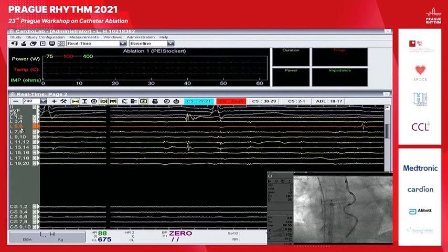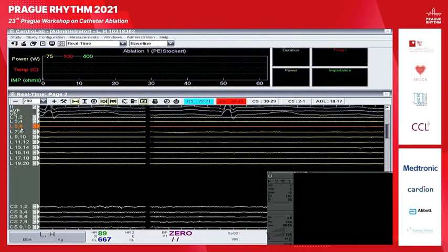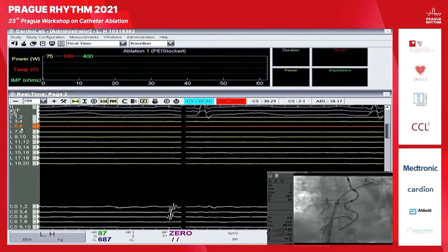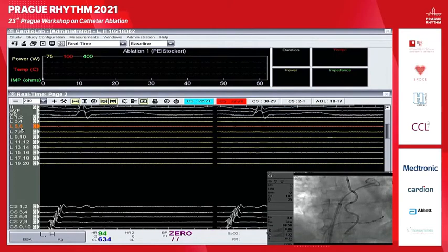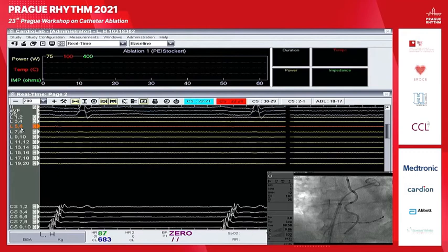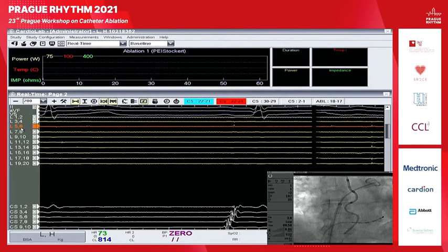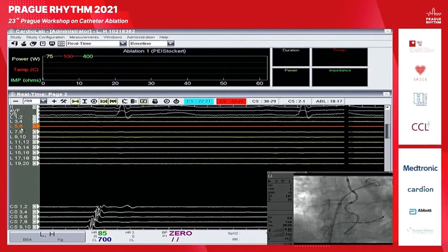checking of the veins. So can we show the baseline measurements from the Prague guys or not? We are not able. Okay, so because of this, guys, the technical staff is not able to adapt our one-off screen, recording screen to the system. So we just can show you what we have as a current lasso or circumferential catheter recording.